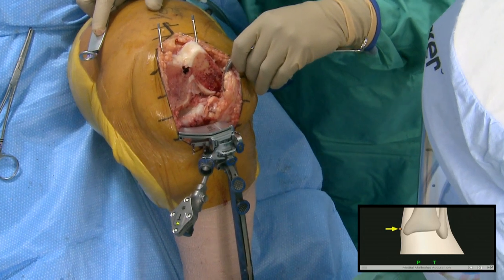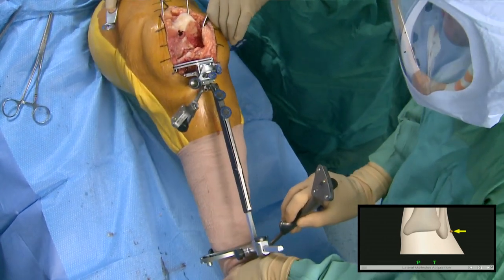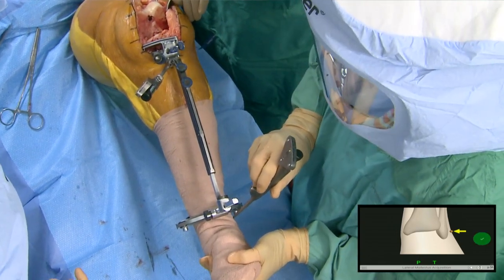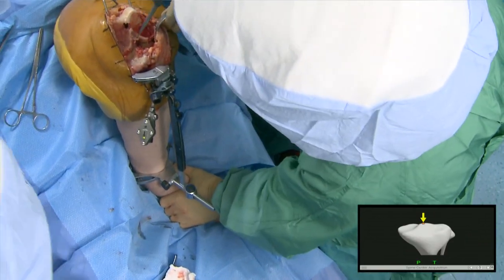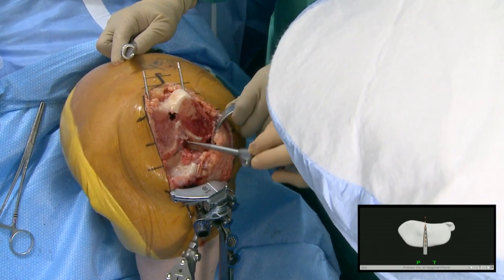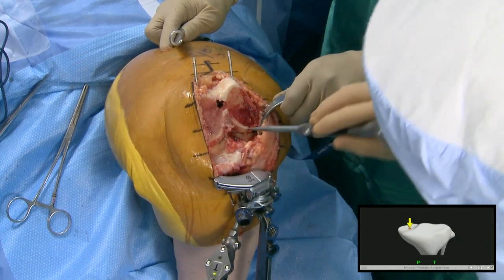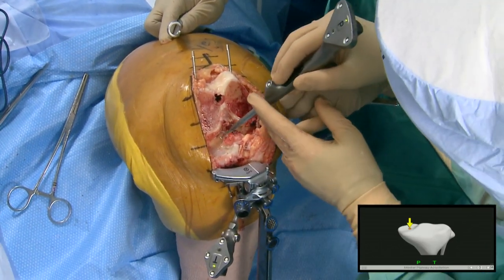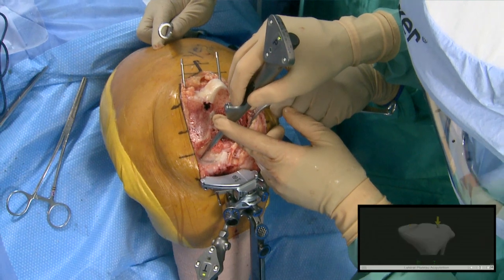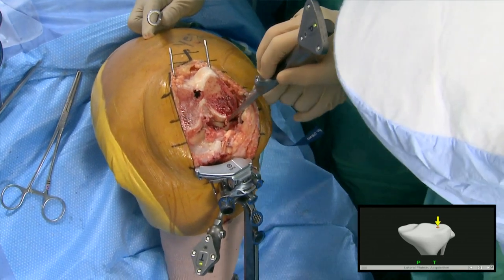We register the medial malleolus just like yesterday, then the lateral malleolus. We get the ACL point — one point where your IM entry point would be — to tell the computer the tibial rotation because that affects slope and varus-valgus. Then one point on the tibia medially and laterally where you would put your stylus, basically at the low point on each side.